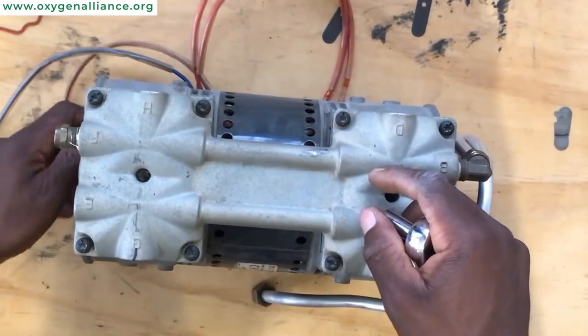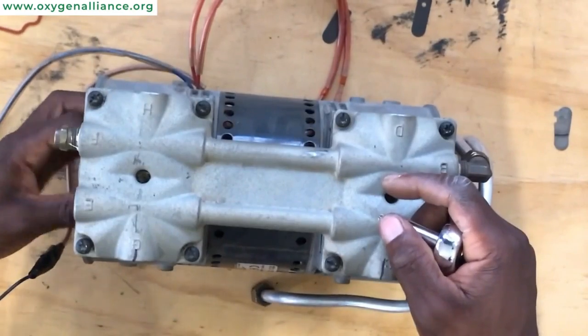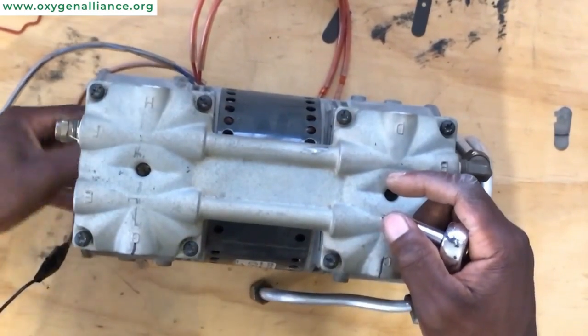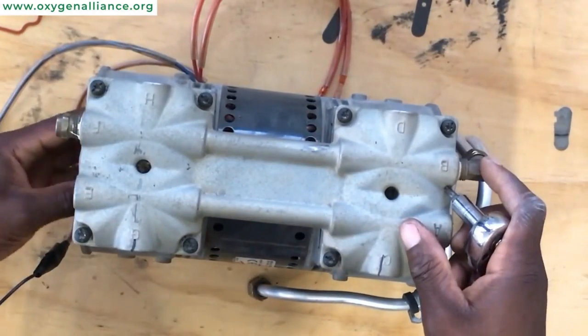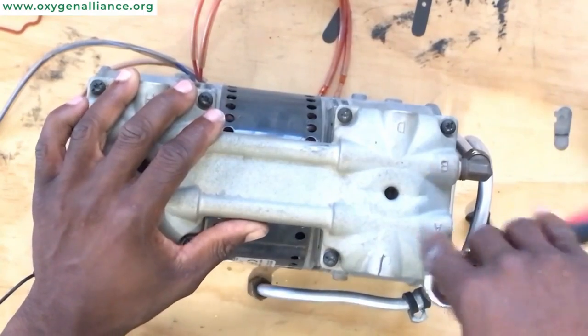Now we have finished screwing down our compressor. You can try to rotate it to feel if it's rotating nicely. You can actually hear a hissing sound when you rotate the compressor, and that tells you that everything is now working perfectly.